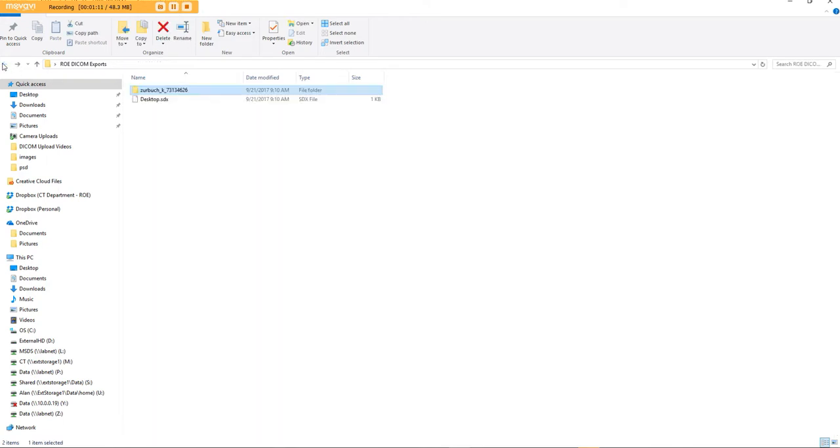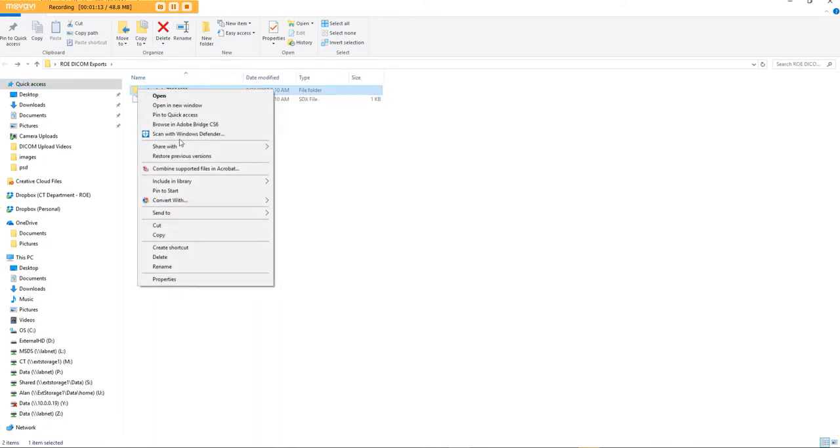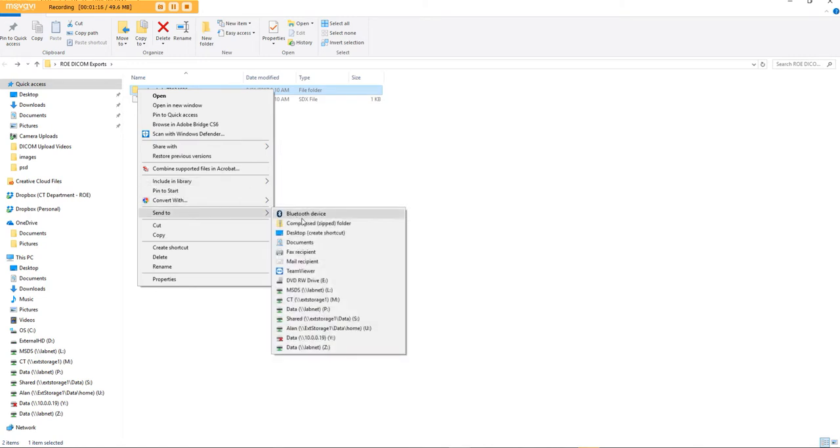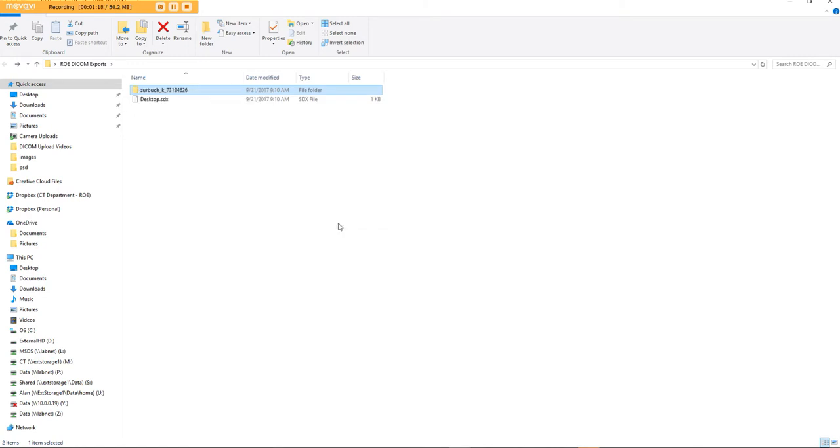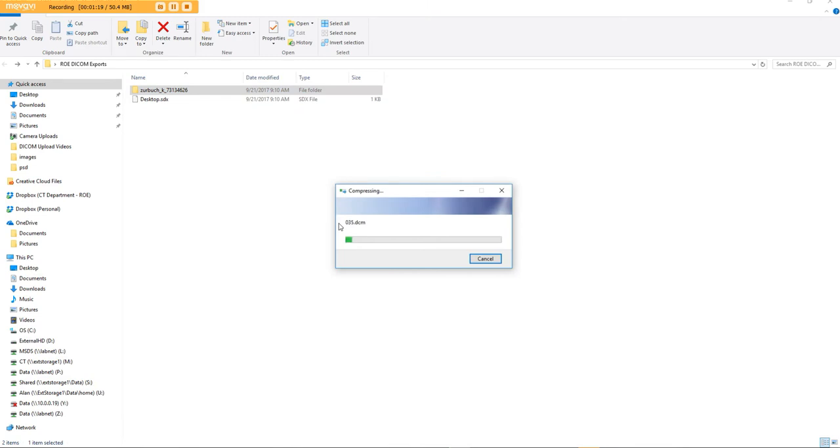You go back, you right-click, Send to Compressed Zipped Folder. It'll make another folder right next to it that has a little zipper on it, and that is what you'll upload from our website.